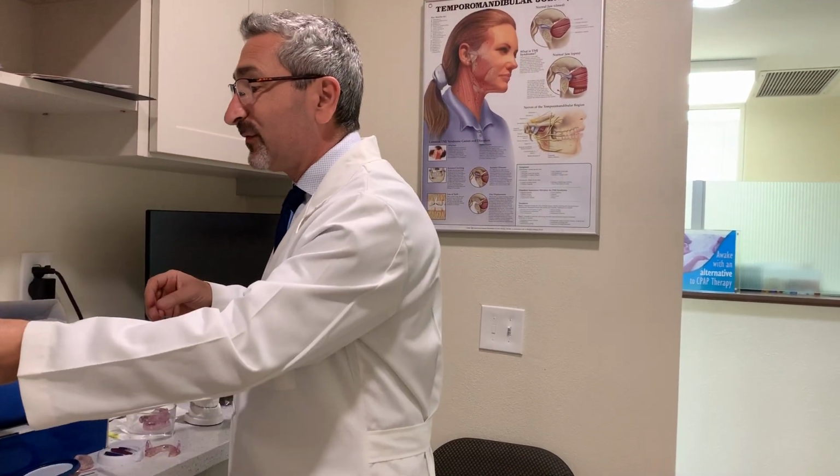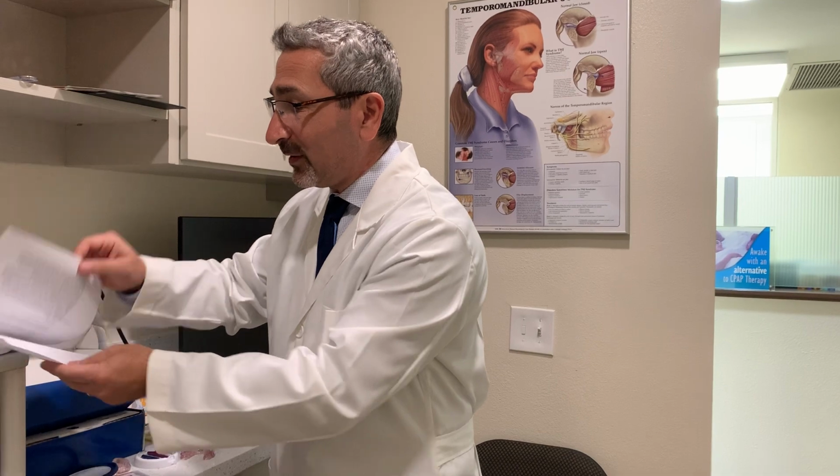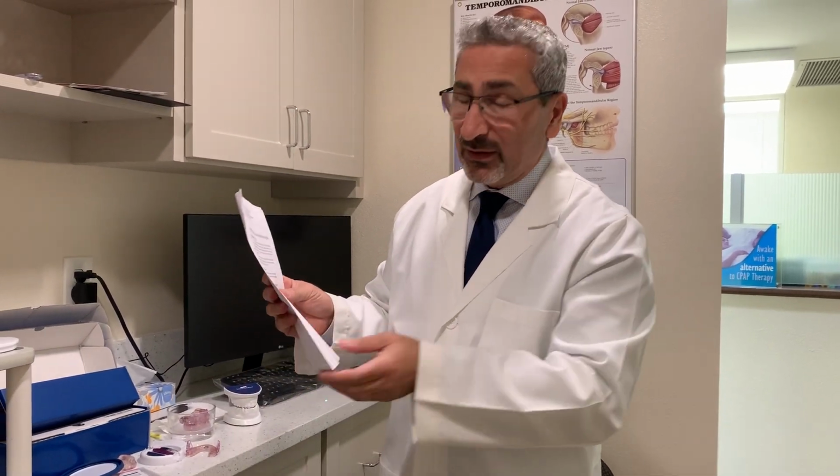It's very important as you're using the mouthpiece, if you have minor issues, such as some of the symptoms that we talked about, a little bit of sensitivity, a little bit of even muscles or jaw soreness, that's okay. But if you start having severe pain, something does not feel right, stop wearing the mouthpiece until you are able to come and see me at the sleep center.